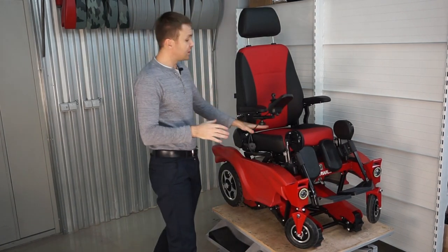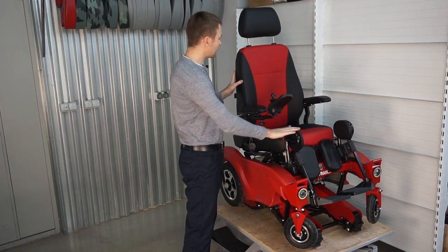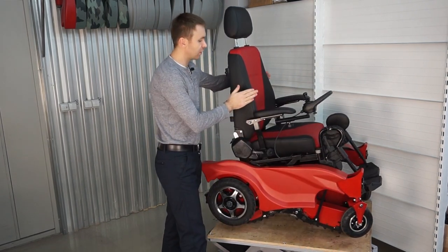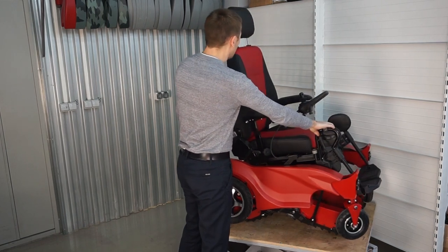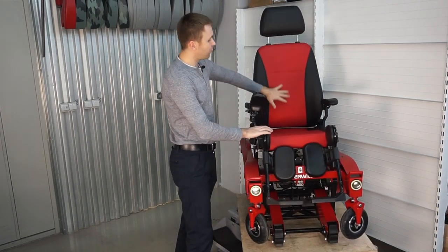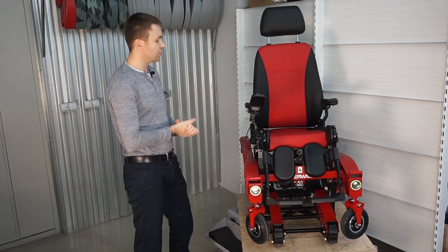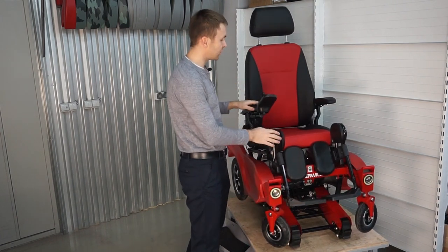The next feature is the seat. This is an orthopedic seat that has side support on the back and bottom. The central part of the seat matches the color of the whole wheelchair — a blue wheelchair has a blue insert and a grey one has a grey insert.